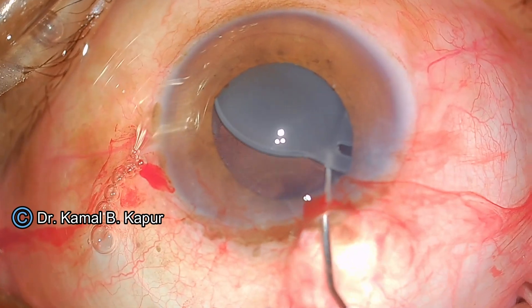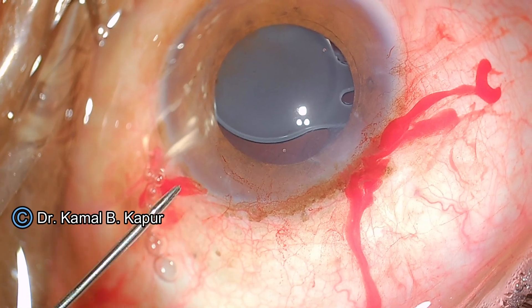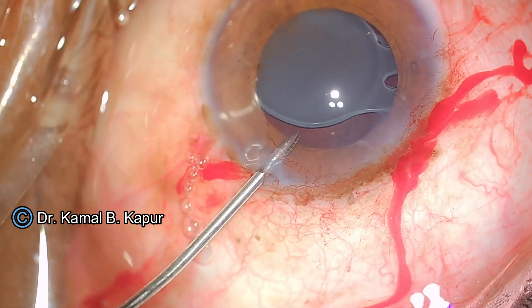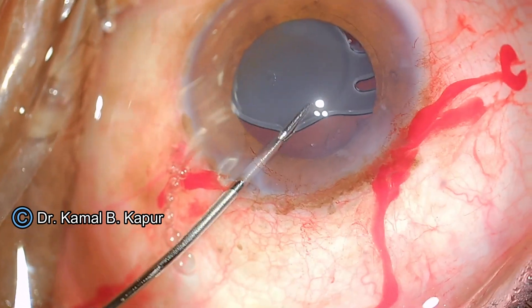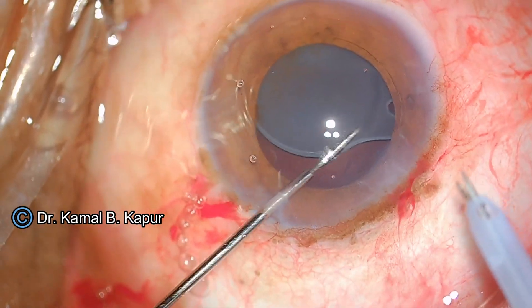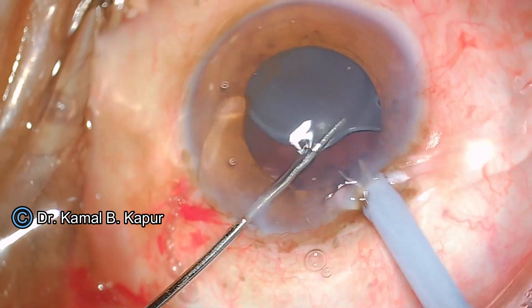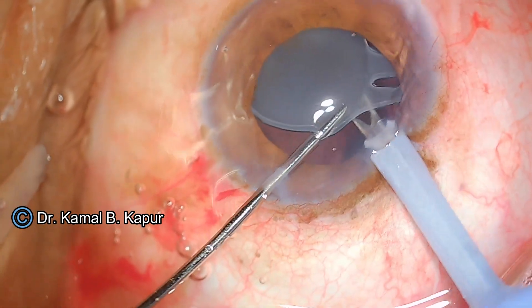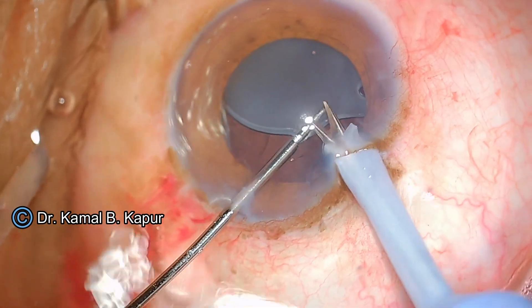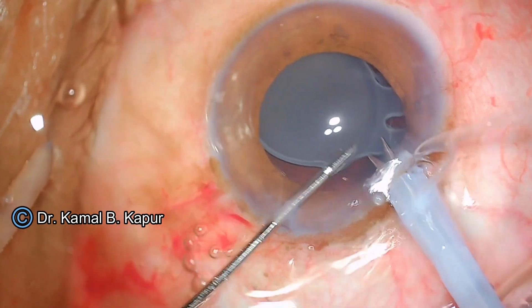You will notice that the IOL is lifted up — this creates enough space between the IOL and the posterior capsule. Now I use a 23-gauge grasping forceps which is provided along with the IOL cutter itself. You will notice that insertion of this phaco cutter is not so easy.